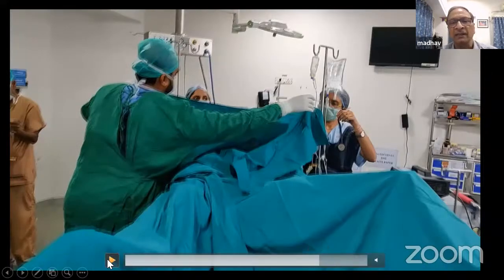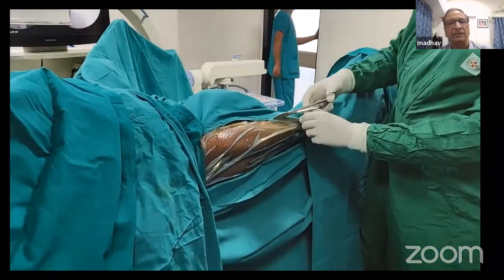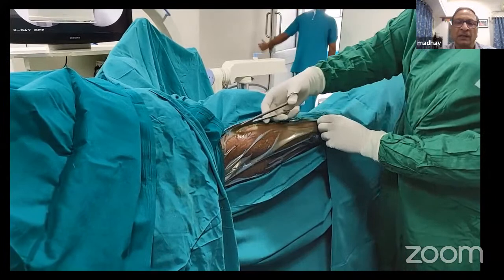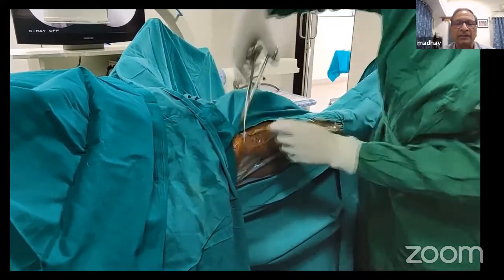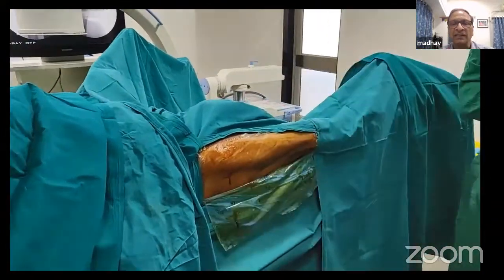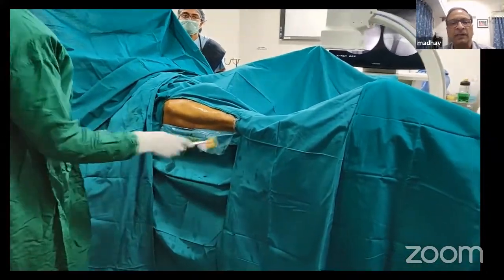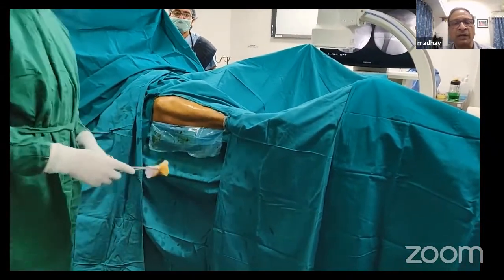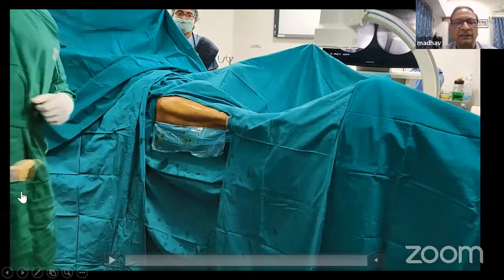Lastly, you put a screen and isolate the head end. The anesthetist takes the sheet and puts it over. Lastly, you cut the plastic drape and turn it onto itself from 3 sides, keeping one side intact. Clean it with sterilium and your operating field is ready for you to start the surgery.